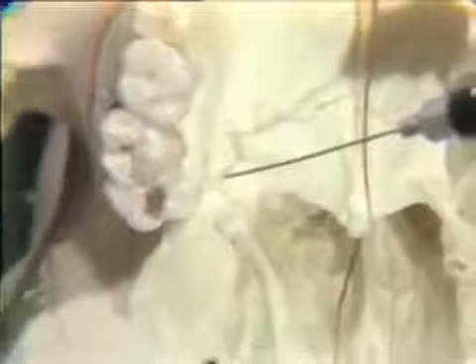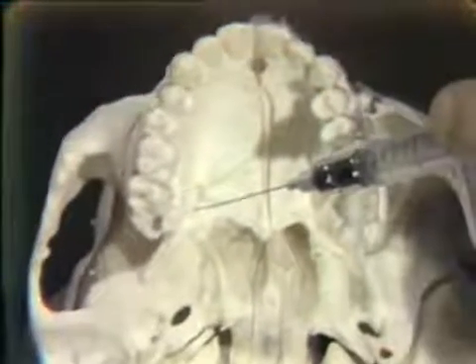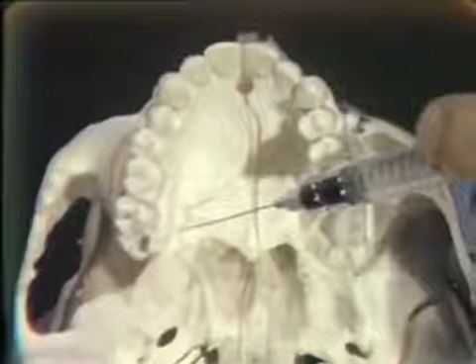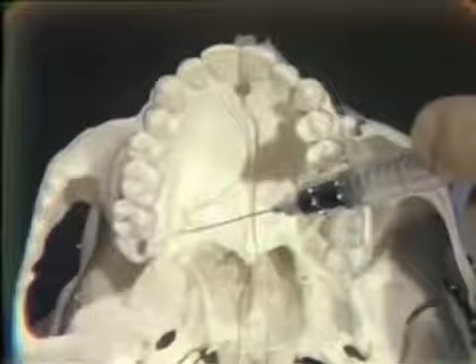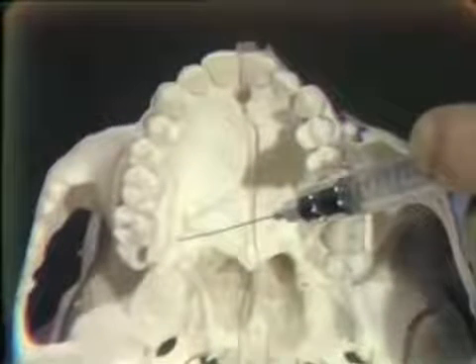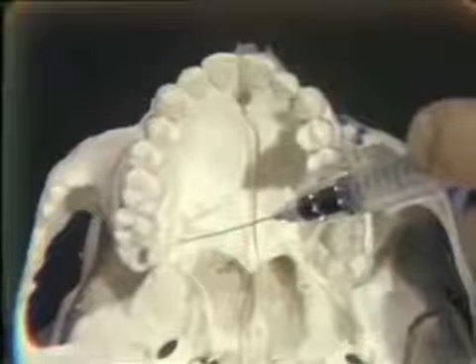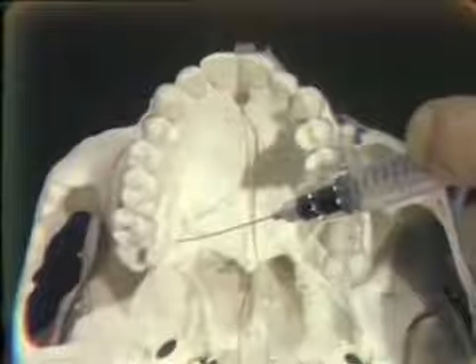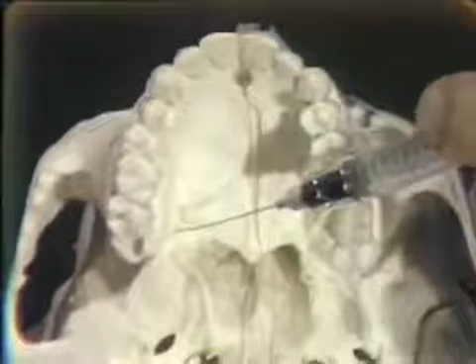And we deposit just a few drops of solution after aspirating, and you will find again that with these palatal soft tissues, due to their fibrous nature, it is difficult to expel solution from the syringe into the tissues, and you have to bring to bear quite a little pressure on the plunger to do so. You will normally see the tissues blanch in this area due to the vasoconstrictor in the solution. And as you observe this, you will know that you have got a few drops at least of solution out into the tissues here just anterior to the foramen.